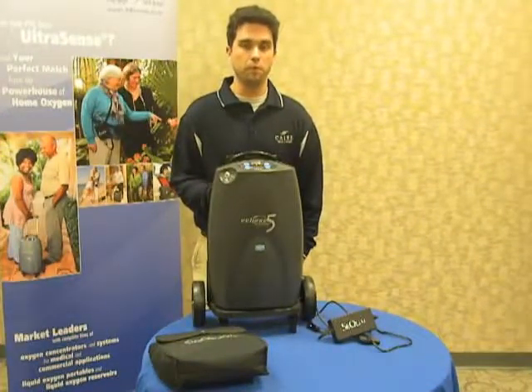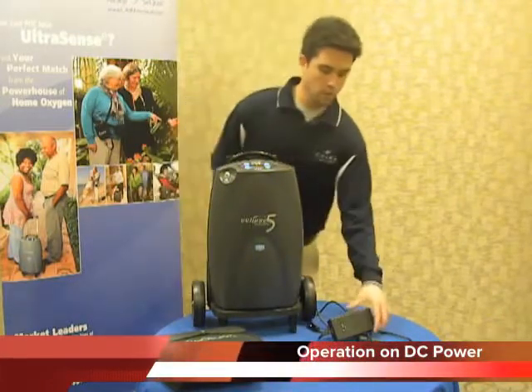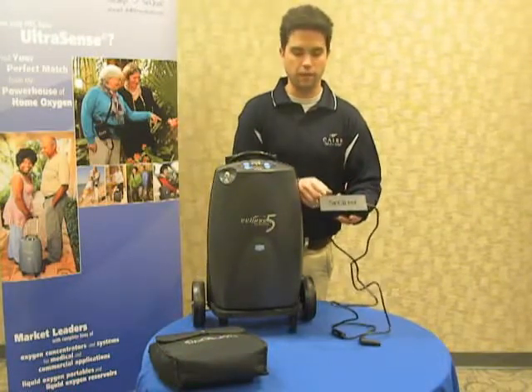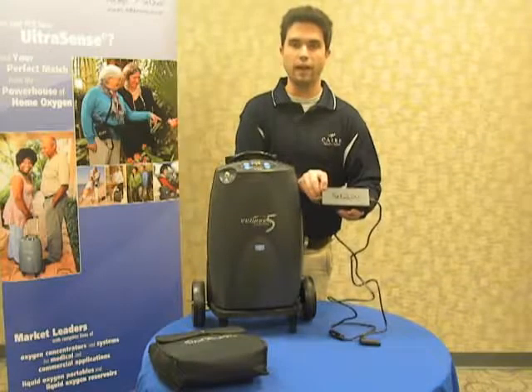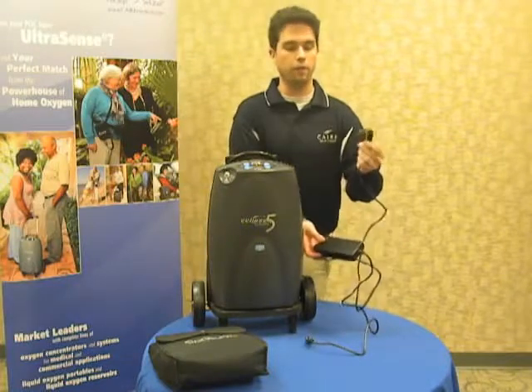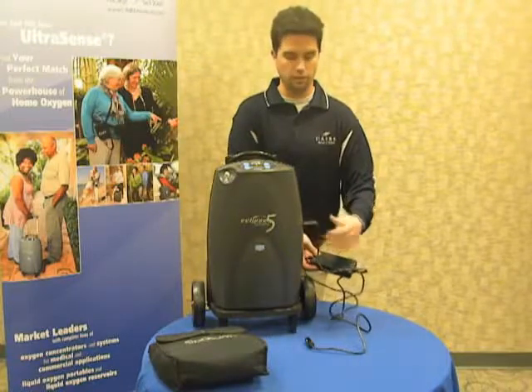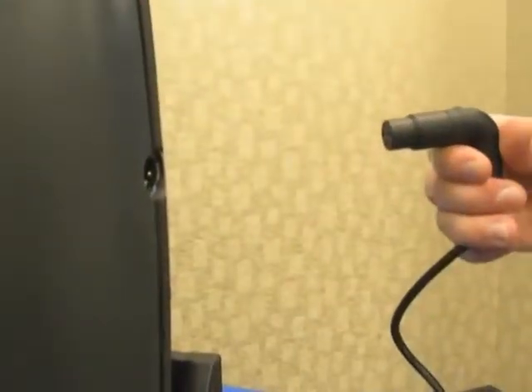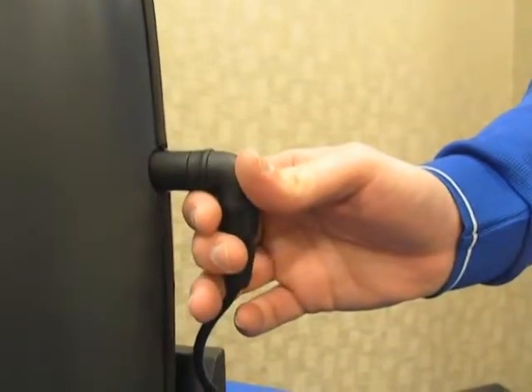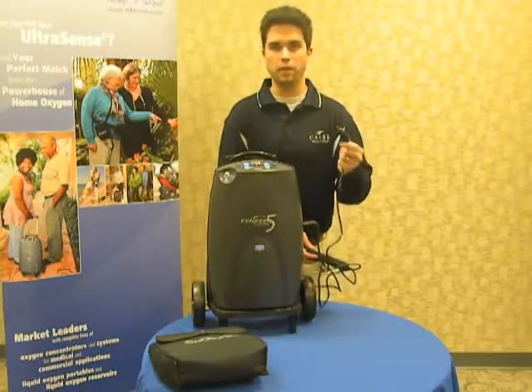Now we'll talk about the last power source, which is DC power, which is generally used in a motor vehicle or a car. Here's your DC power supply that comes with the unit. Note that it's pretty much just a smaller version of the AC power supply. You still have the brick here with a light in the top corner indicating that you're receiving power. On one end, you have your elbow connector again with the arrow on top to indicate plugging straight in upright to the side of the Eclipse. On the other side is your standard connection that will go in an accessory DC outlet of any car.